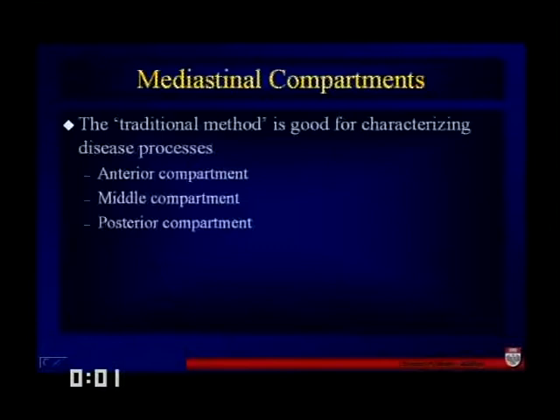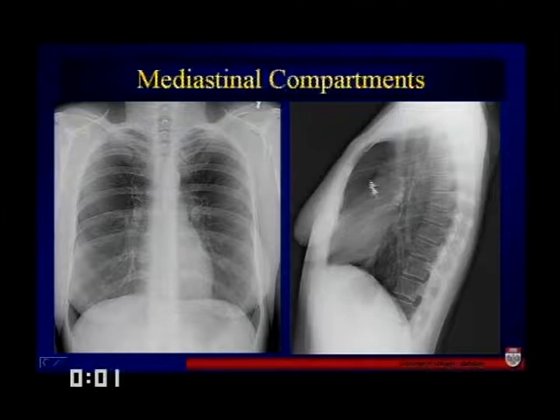The traditional method is what we're used to in terms of an anterior, a middle, and a posterior mediastinal compartment, and it's very good for characterizing disease processes. For a brief review, we have the anterior mediastinum here, the middle mediastinum, and the posterior mediastinum, and we can see normal interfaces. You can probably see a junction line anteriorly here — everything looks nice and clean.